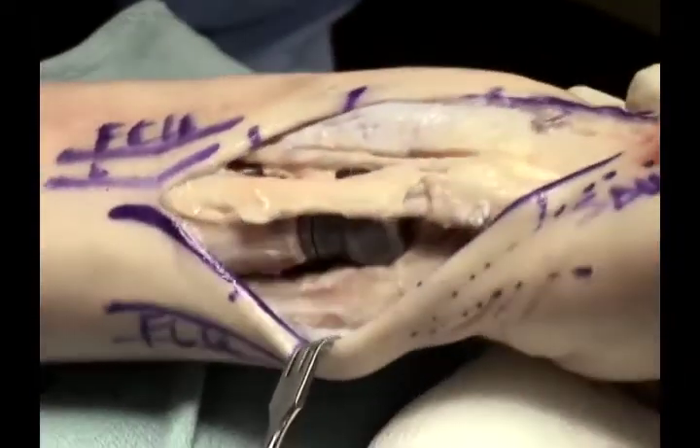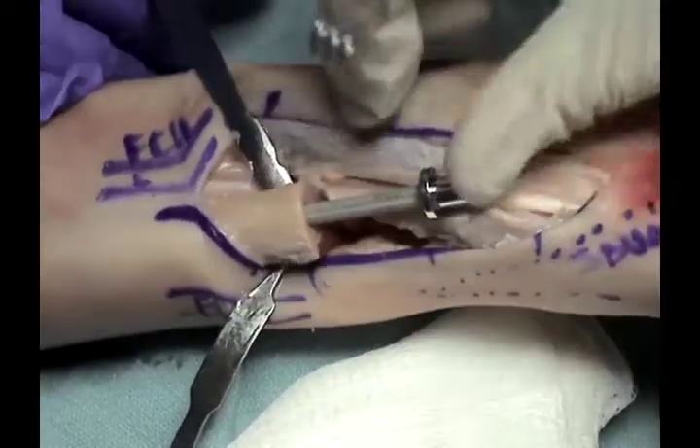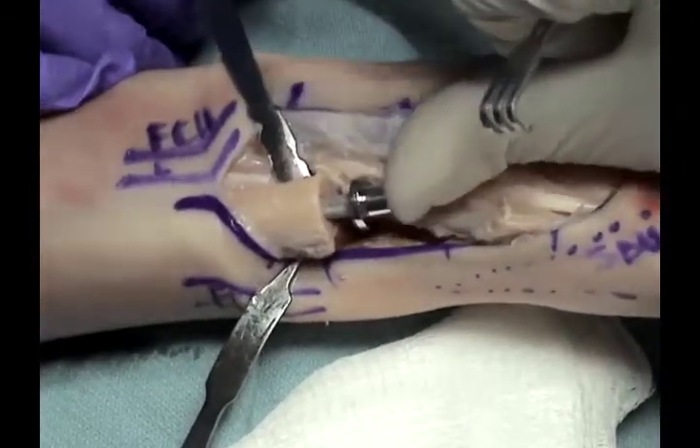Once the trial components demonstrate stable contact with the sigmoid notch, the final components can then be inserted and the stem is tamped into position.